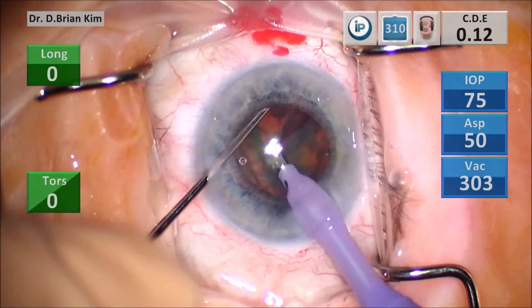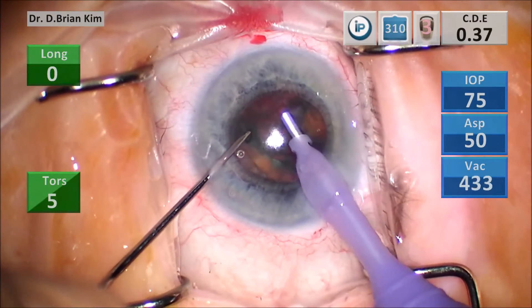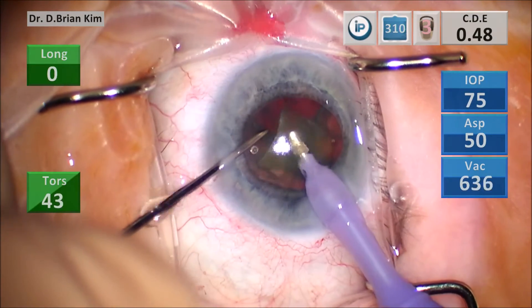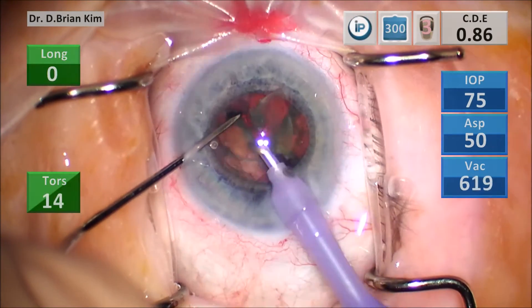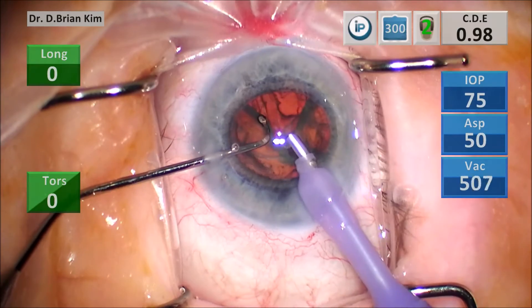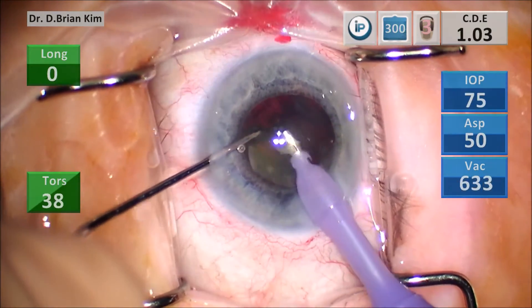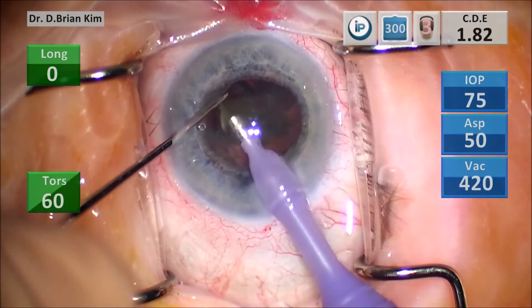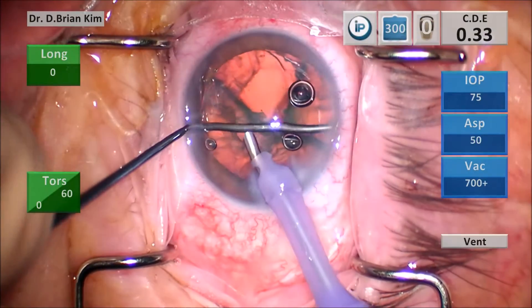I go all the way out and around using my chopper up to the equator, pulling the fragment centrally into the central safe zone, and then emulsify. The principal movement for mobilizing endonucleus is to go out to the equator and pull that fragment centrally so I can attack it with the phaco tip and emulsify it.